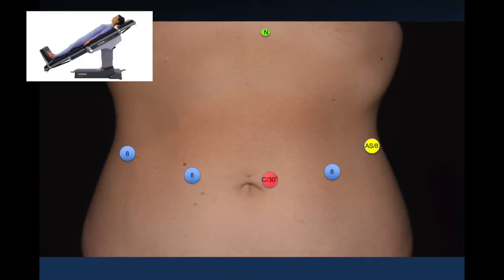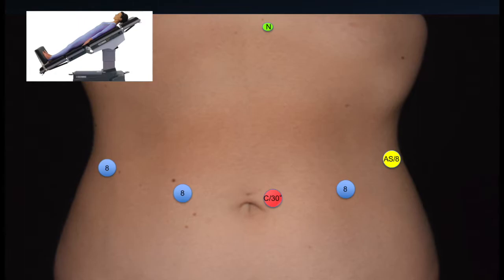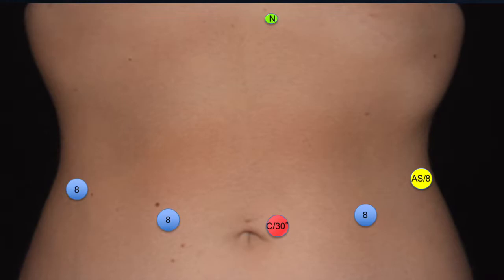Here's my port setup. I use all four arms, with a 30-degree down camera just to the left of the umbilicus so you're out of the way of the falciform ligament. I use an 8-millimeter air seal assistant port on the lateral edge. The patient is in steep reverse Trendelenburg position, my assistant is on a sitting stool next to the patient, and I use a Nathanson liver retractor in the sub-xiphoid space to retract the liver anteriorly.